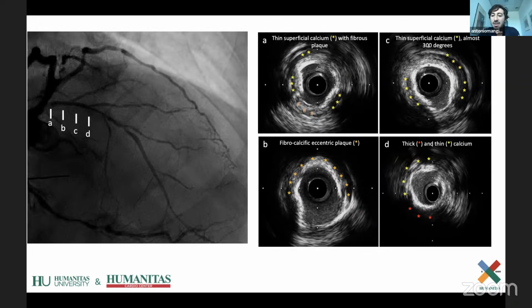That's the thing we need to bring out for the fellows, right? That in this case, because it's so diffuse, the risk of distal embolization is higher. Compared to the cases you showed us before, where they were more focal, this is much more diffuse disease.